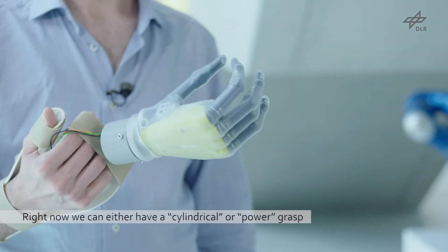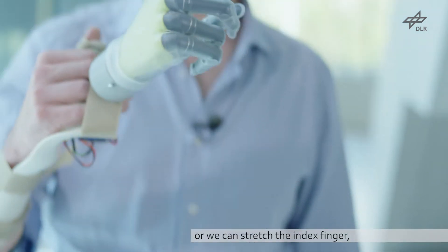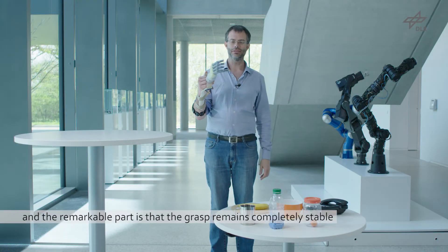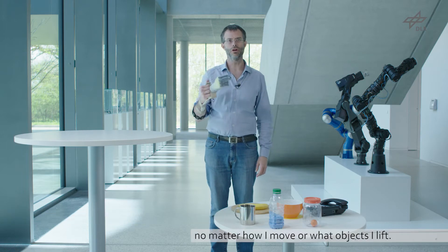Right now we can either have a cylindrical or power grasp, or we can stretch the index finger. The remarkable part is that this will remain completely stable no matter how I move or what objects I lift.